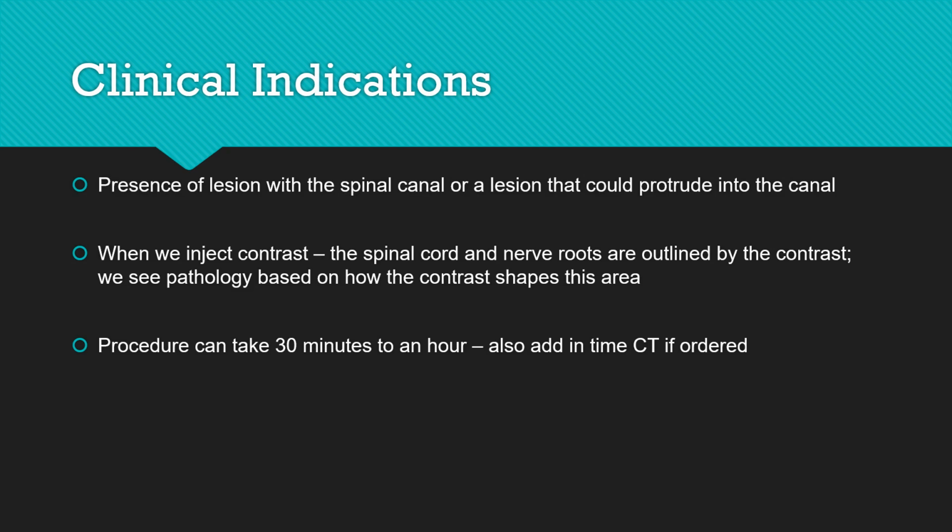Usually when patients schedule these exams, they're there for about 2 hours. They have to get there, make sure that all the consents are signed, go through everything, and get dressed before the procedure. That takes about 30 minutes, and then the procedure for the myelogram takes 30 minutes, and then the CT takes an additional 30 minutes. And that's if everything is running smoothly, but usually another CT is always being done while you're waiting, or patients show up late. Sometimes their appointment's at 10 o'clock and they show up at 10 o'clock when they were supposed to show up at 9:30 to make sure that they register and change.